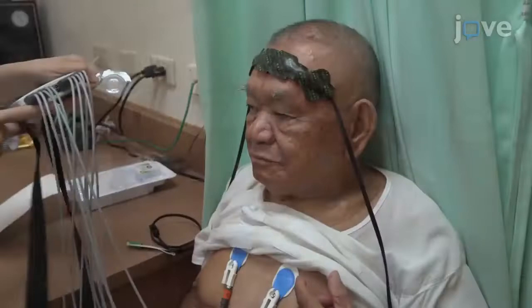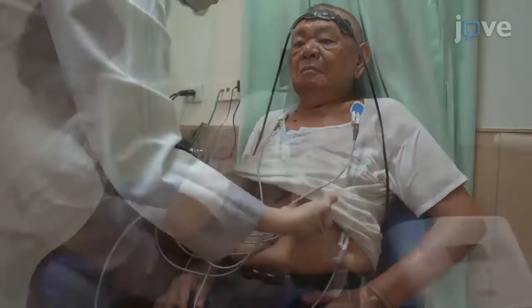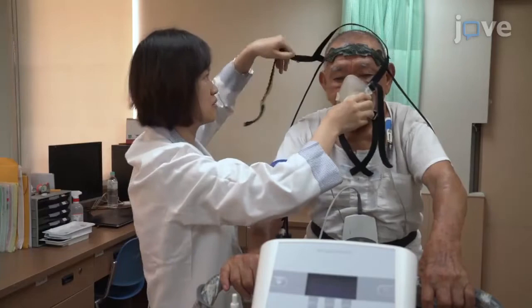Next, apply EKG electrodes to the anterior chest, bilateral acromioclavicular joints, and low back. Have the patient sit on the bicycle ergometer and place the armband of the sphygmomanometer on them. Then wear the mask of gas analysis for the patient. Place the sensors for the pulse oximeter on the patient's index finger.